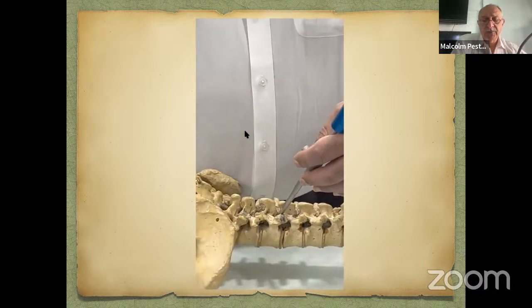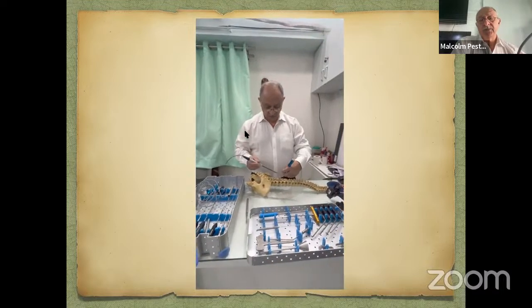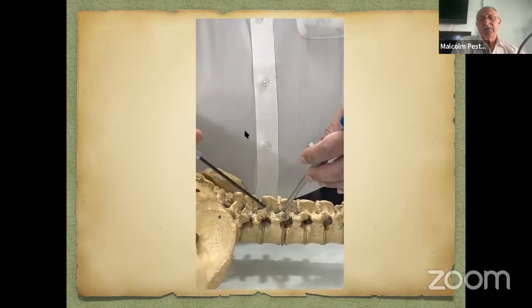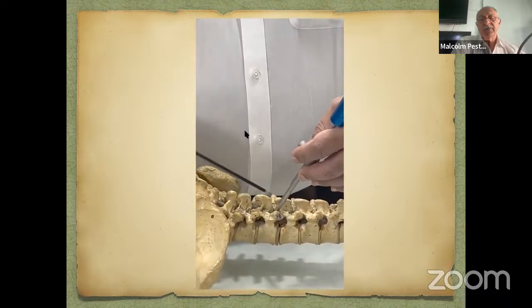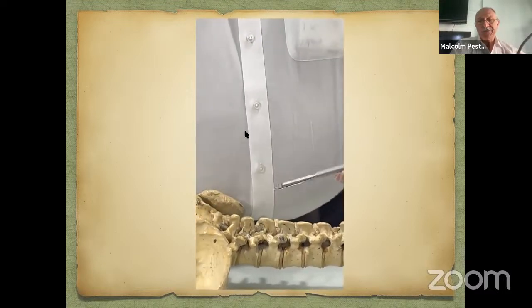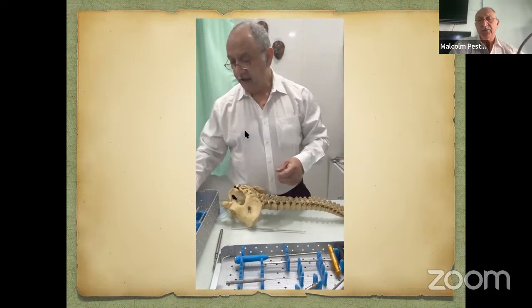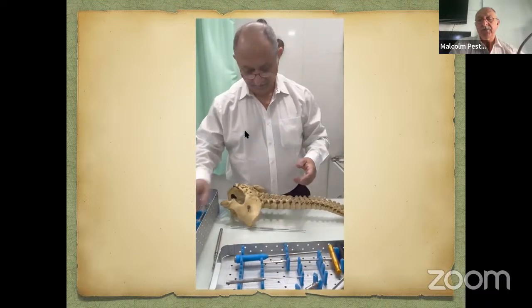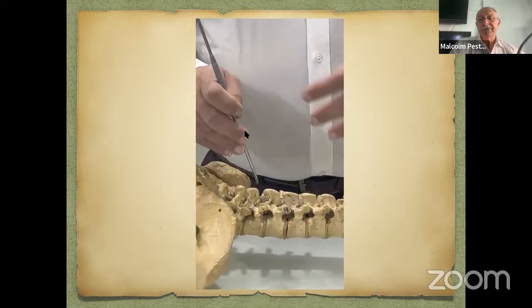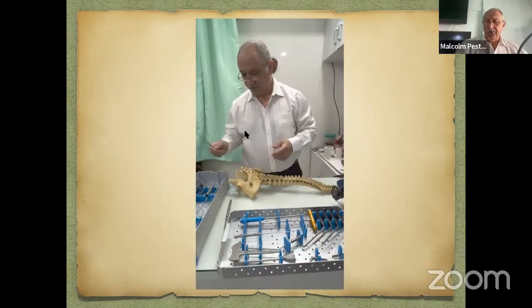Before I do that, I use a plasma wand. This is the plasma wand. It's a radio frequency one, which helps me to strip all my muscles away from the interlaminar area and the fascial ridge, exposing the flavum. Now, if the interlaminar window is large, you can thin out the flavum with a punch. And then with a gentle dissector, you can do a flavotomy in the interlaminar area, introduce a Kerrison, and start your surgery. Thank you.